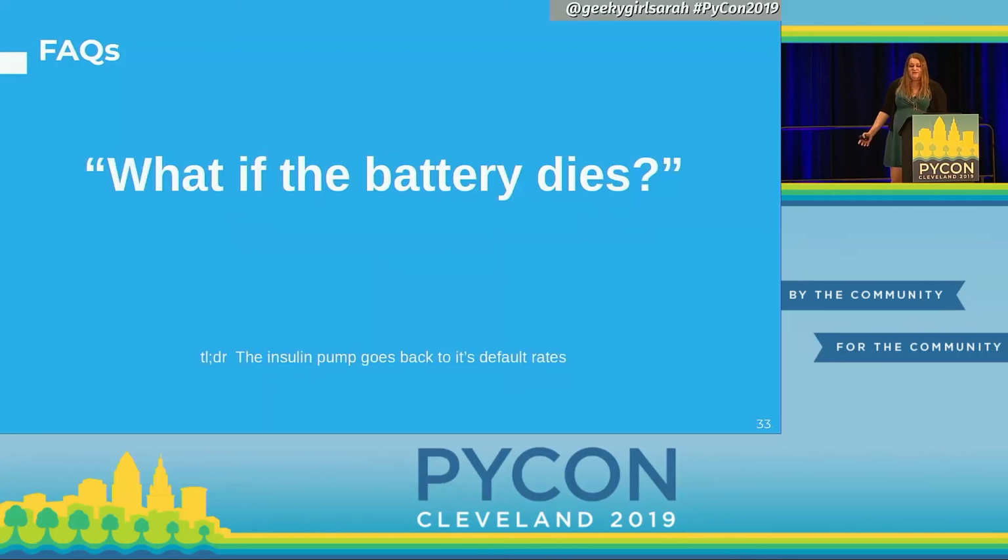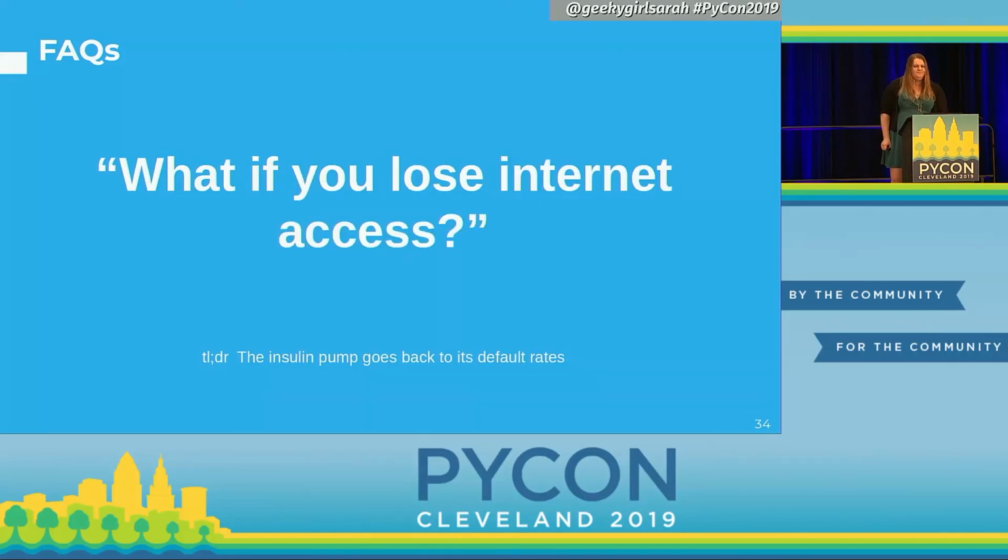What if the battery dies? Good question. So yes, I have to charge my pancreas. It happens. So if it dies, then the pump just doesn't hear anything anymore. That temporary value quits, and then it goes back to its default. So it goes from basically dynamic back to static. It doesn't kill me or anything like that. Same for if it loses internet access. Since it can't get those values and can't really detect the trends, it just goes back to that default status, which is sort of what's happening now because it can't read the things on my blood sugar meter.